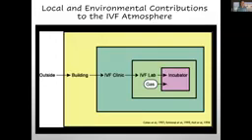So the local and environmental contributions to the IVF atmosphere can be compartmentalized. Obviously, everybody thinks that outside is the biggest polluter. In actual fact, most of the VOCs and aldehydes can be found inside buildings, inside medical buildings, and inside IVF labs, and even inside machinery such as incubators or in medical gases. If we look at the ratio of that, the outside is usually 2 to 5 times cleaner than the inside per VOC, and sometimes it's 10 times cleaner. So it's important to get outside air ventilating through laboratories and IVF clinics.